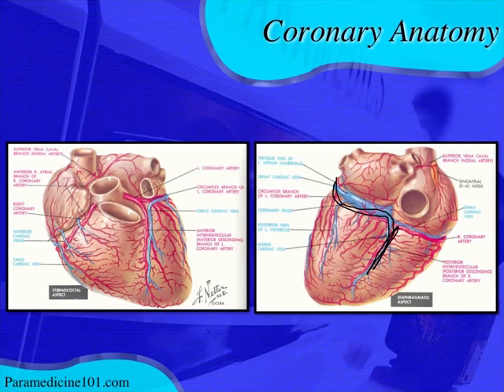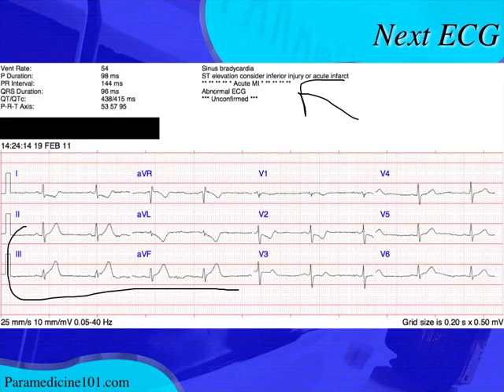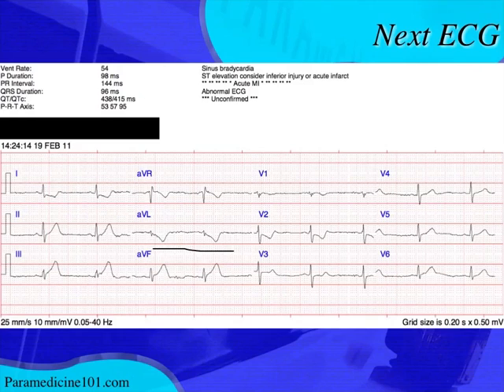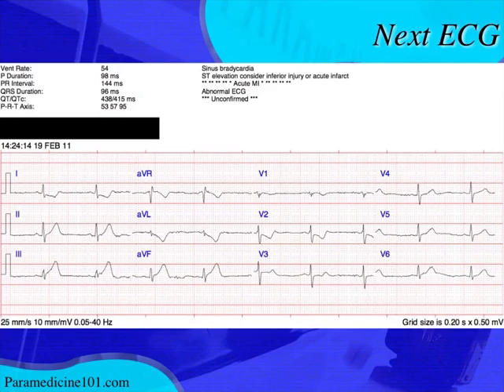We got a second 12-lead from the crew that ran the case, and this time it called an acute MI. It's an inferior wall MI — ST elevation mostly in lead III, a little in AVF, with reciprocal changes in the high lateral leads, especially AVL, which is a very common early finding in inferior wall MI. You should also know how to do a posterior 12-lead because posterior changes can sometimes be the first finding. This pattern is also indicative of a possible right ventricular infarct.